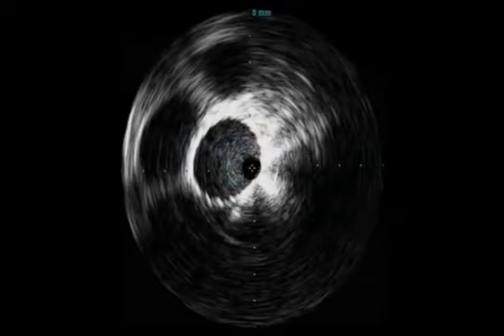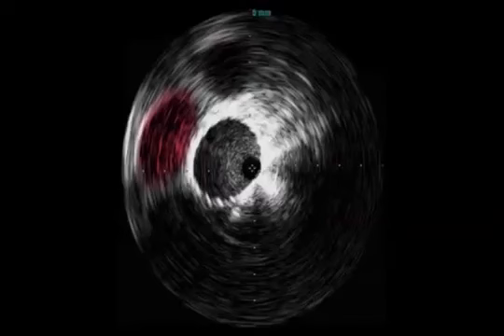now we're in the area where the lesion was. So this was the left common iliac vein compression site. You can see where we saw earlier the division of the artery, so the left common iliac artery and the right common iliac artery. This was compressing the vein closed, and now it has a metal stent completely opposed to the wall of the vein. The vein's big and round now. It's no longer compressed.